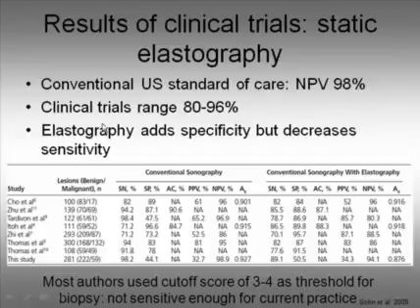And in the clinical trials utilizing static elastography, the negative predictive values ranged from 80 to 96%, which is not quite enough for us to not do a biopsy.